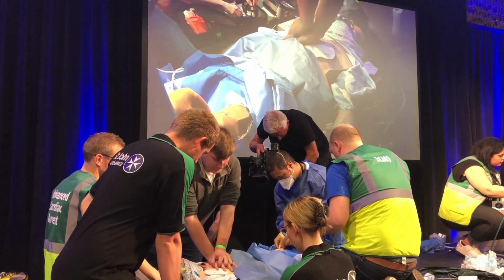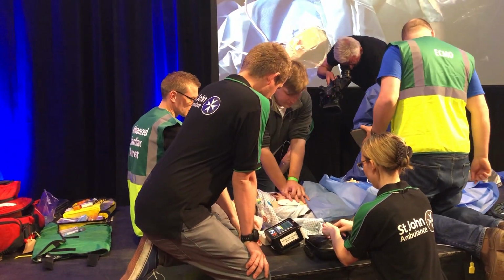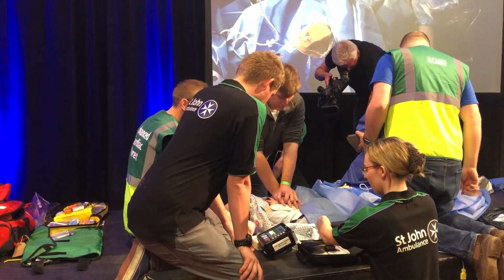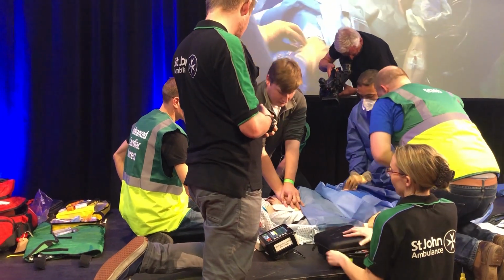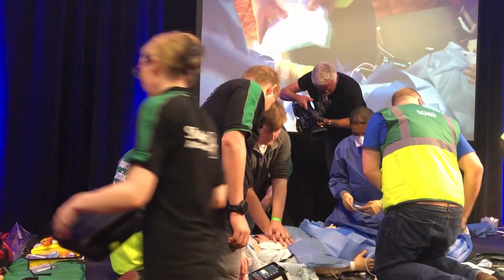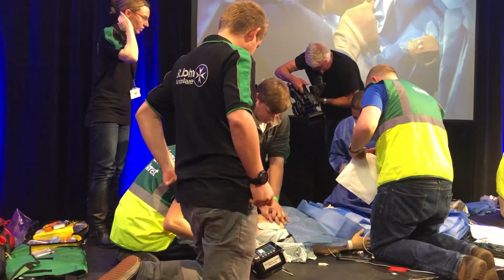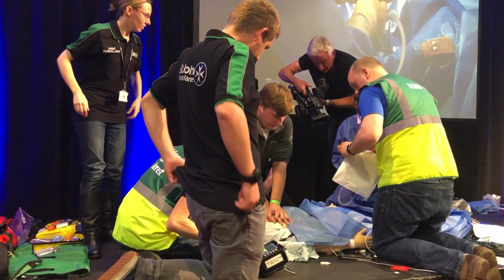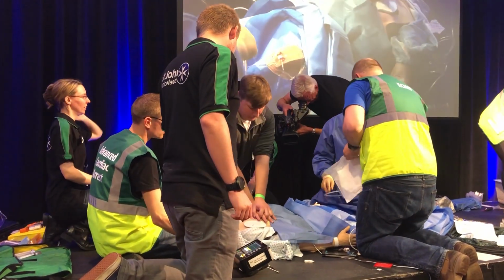So you may see us pause just to pass a wire at that stage. And we may say to delay the shock for a second to have hands off the wires. Normally, we've lost all the metal things that can arc and give you electric shocks, and most of the time you can hold a patient while they're shocked and be absolutely fine. But we've got wires in their heart, so that's the one time we might get a little bit of warmth with the shock if we're holding one of those wires.